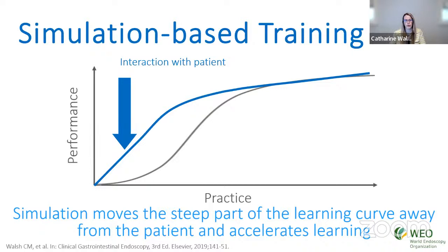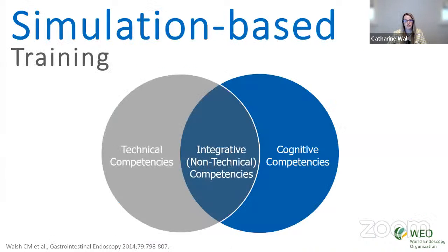And this is really for more novice endoscopists. But simulation is increasingly being used not only for novices, but also for more advanced trainees, as well as practicing endoscopists. And it's not only for technical skills related to endoscopy, such as scope handling or loop reduction or polypectomy. It's also for cognitive skills, such as lesion recognition, as well as non-technical skills, such as teamwork and communication. We can really use simulation across all of the skills that encompass endoscopy competence.